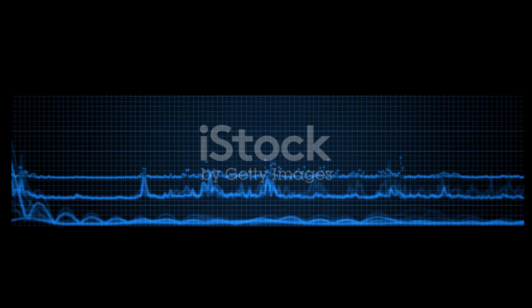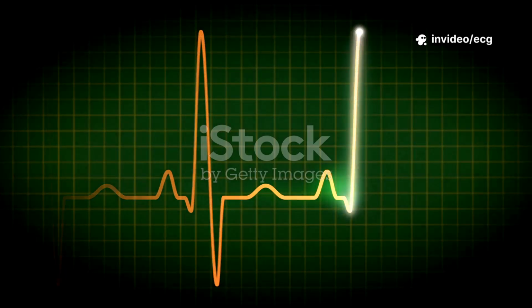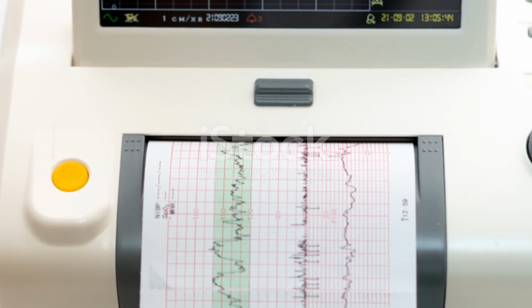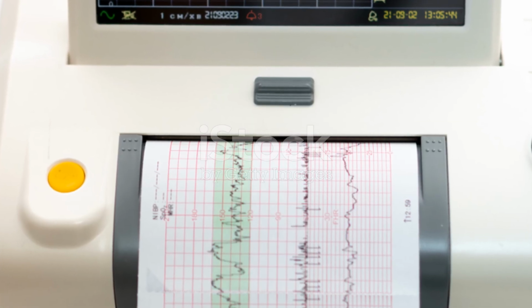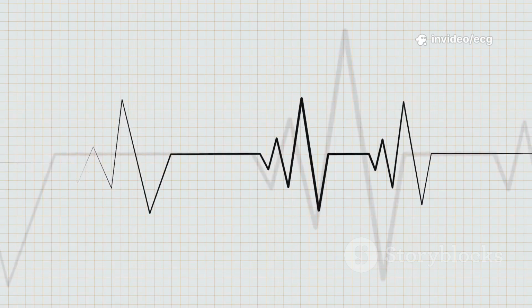A reliable system is your best defense against missing important findings. Following the same 10 steps, in the same order, every single time, trains your eyes and brain to be thorough. The first step is simple but crucial. Check the patient's details. Confirm the name, confirm the date, confirm the time.